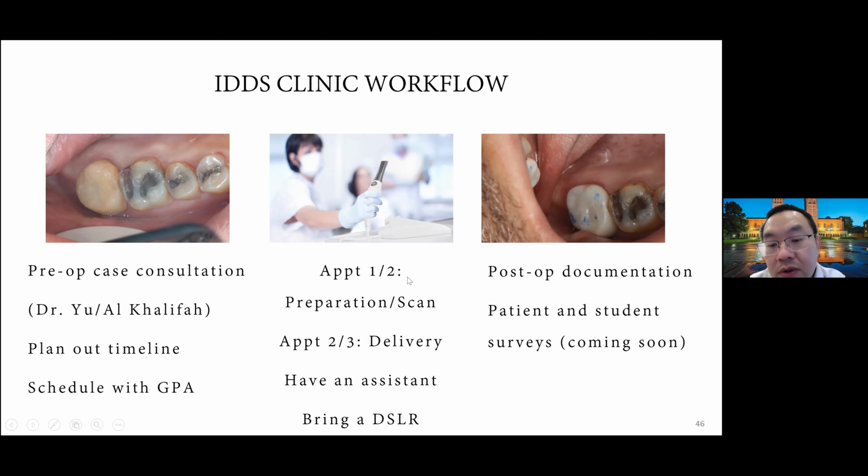You still need to provisionalize the patient. Even if it's for same-day delivery, we still want you to learn how to do a provisional correctly. So we're still going to ask you to provisionalize. The second or third appointment is going to be the try-in and delivery.